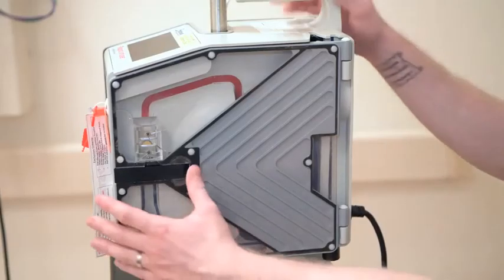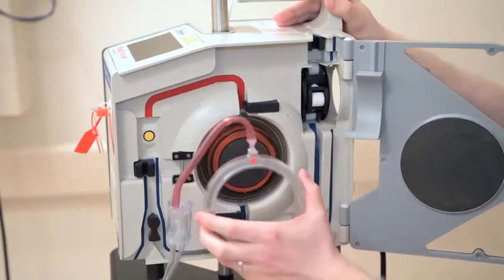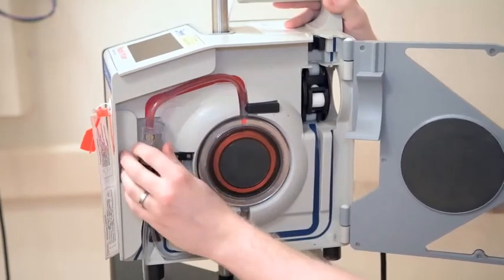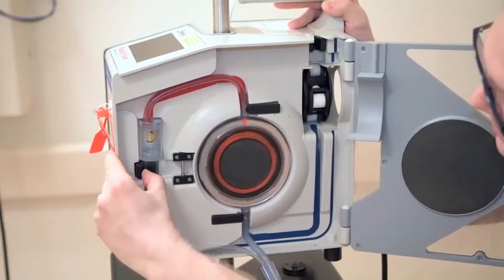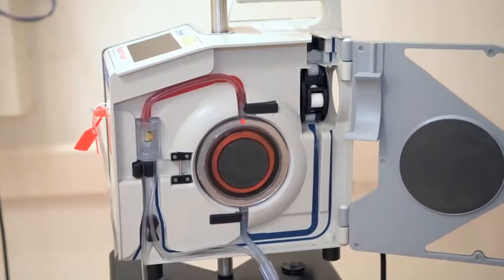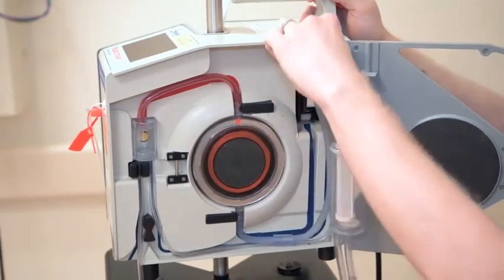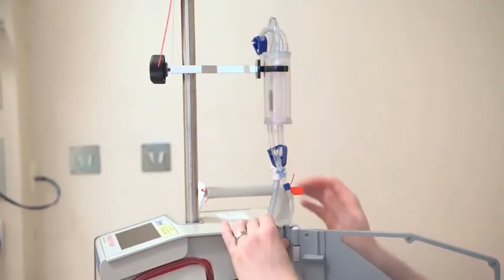To load the cassette, you just need to take the black lever on the side of the Belmont itself, open the Belmont up, and take the cassette so that you've got the red arrow pointing to 12 o'clock and facing you. Pop that cassette into the machine, make sure that you follow the red line and place the chamber just onto the chamber holder, and push this little tube into the black holder here. Then take this piece of clear plastic with the blue arrow on it, which sits on this little shelf here, pop that inside the Belmont, bring this chamber up, connecting the chamber to the chamber holder.